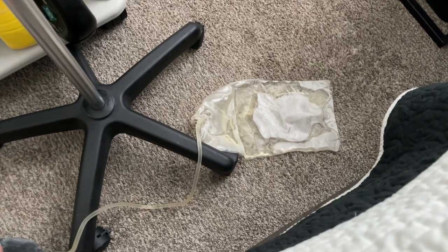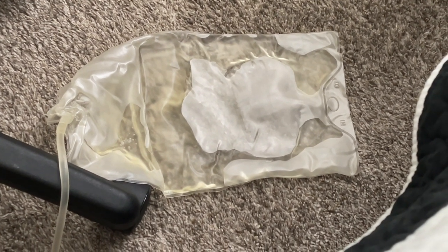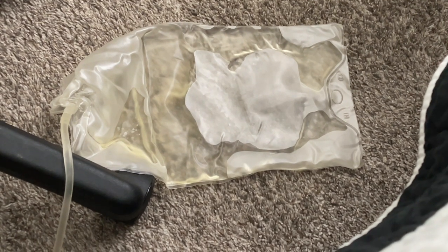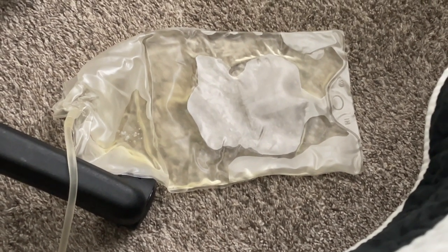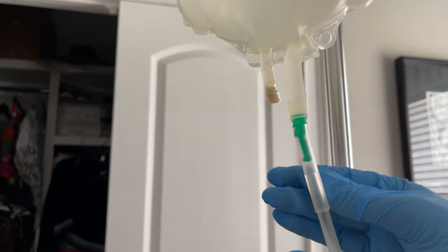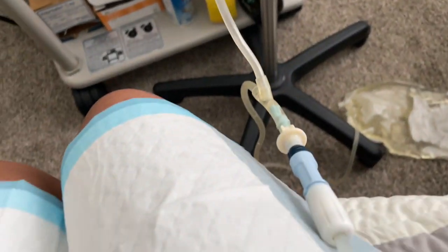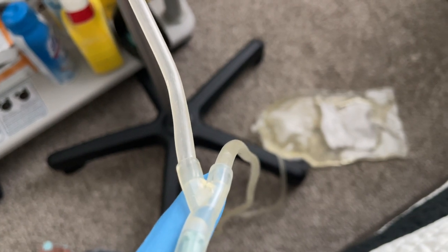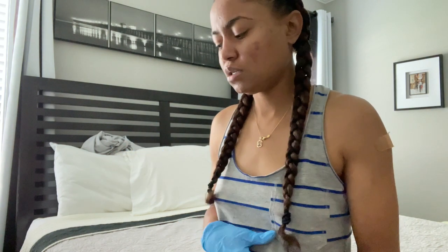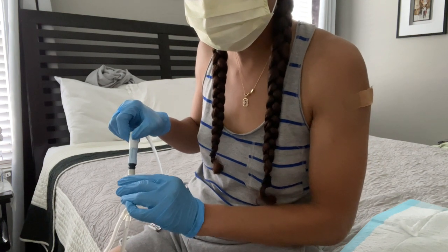As you can see it's draining — with the use of gravity it is immediately draining into the bag, collecting the fluid from inside of my abdomen. Depending on how much fluid you have in your abdomen determines how long this will take. For me this process takes about 15 minutes to drain until empty, and my body indicates that by cramping. The green seal is what allows the dialysis fluid in the bag to drain either into your stomach or into the drain bag below — absolutely do not crack this seal until you are ready to fill. The flow has significantly decreased in pace, which means I'm getting closer and closer to being empty. My abdomen starts to cramp, which indicates I'm getting pretty close to empty — I tolerate it as long as possible but I don't allow myself to get in too much pain, so I stop. As soon as the port closes, draining stops and the pain stops immediately.